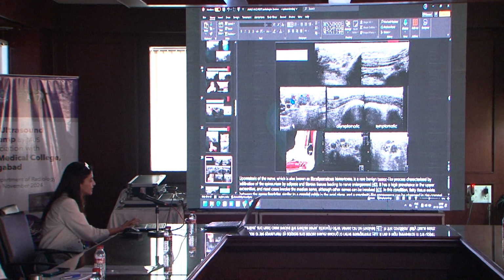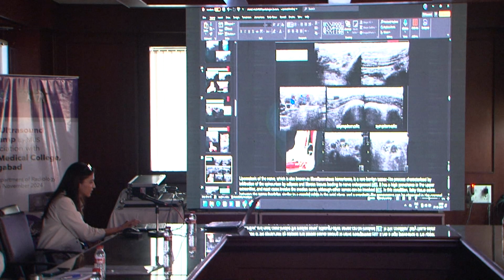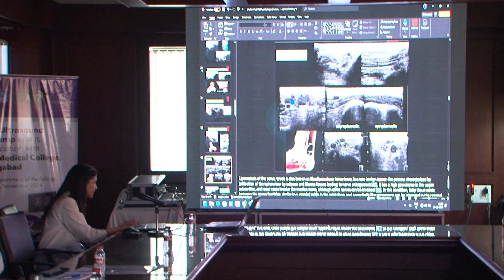Okay. So that's the posterior tibial nerve in the tarsal tunnel. What is happening here is the nerve is thickened. Now we are comparing the asymptomatic side with the symptomatic side. Here we see that on the asymptomatic side the nerve fascicles are nice, smooth, and on the symptomatic side it's all thickened, it's lost its nice pattern. On the transverse axis, this is the nerve on the asymptomatic side and here the nerve is thickened. So this was a case of lipomatosis where there was fat accumulation within the epineurium, within the nerve fascicles.